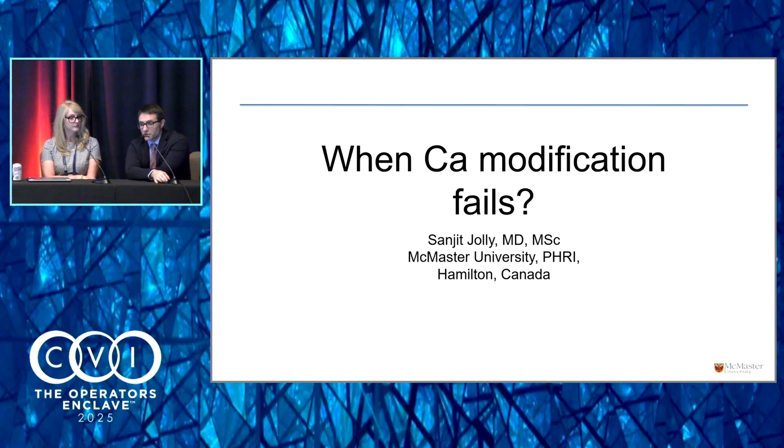Yes, thank you for the question. I think the presentation can give you a little bit of an idea. Yes, it's needed in both situations. The resistant lesions are not only the evil calcified or nodular lesions. The stent is an issue. The stent is the disease, in most of the cases. In the index procedure, not well done, without imaging, without proper lesion preparation, the stent still remains an issue. And we have the same experience as you. IVL in-stent doesn't work; it doesn't open in the same fashion.